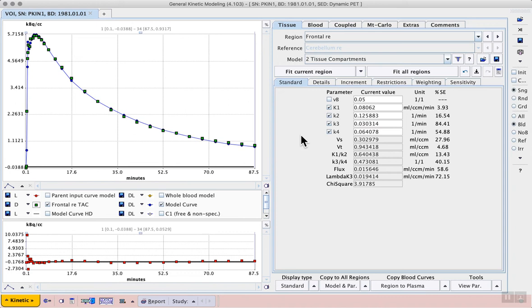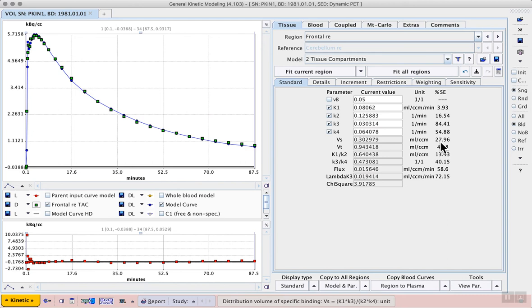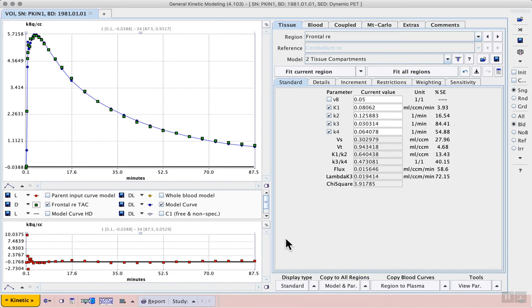The relative error in these estimates is shown to the right of the resulting rate constants, and the residuals between the model and the PET curves are shown in the lower plot window.